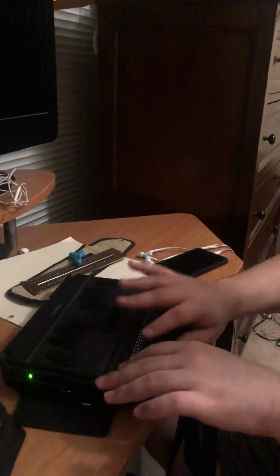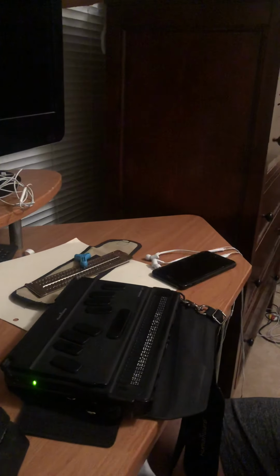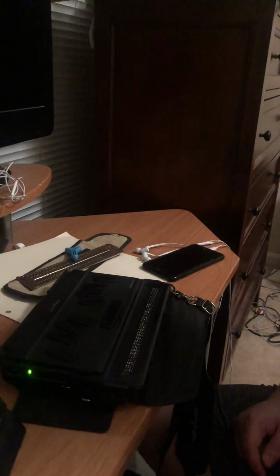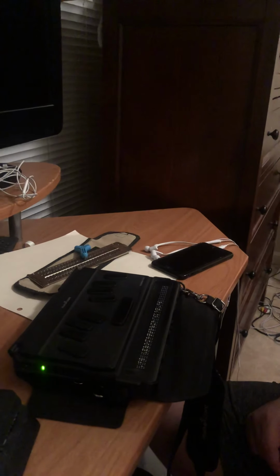There you guys go. So as I stated before, I do homework, I sometimes work for my mom, right, Mom? Yes. If I need to write information down, I just open up a Word document and write in there what I need to write. And then of course, if I would like to read books, I can use this as well.